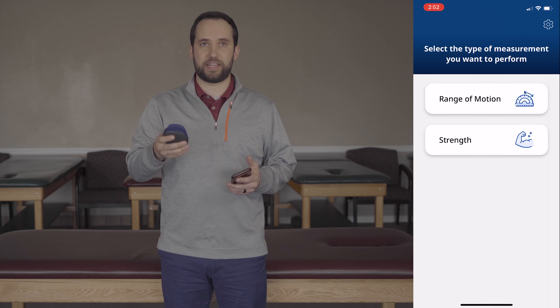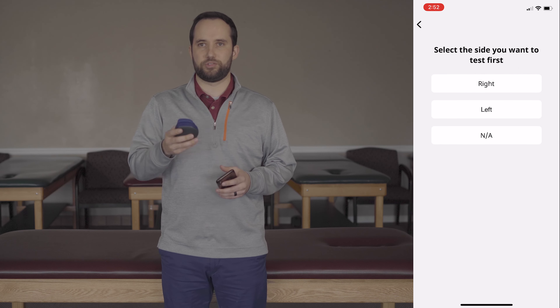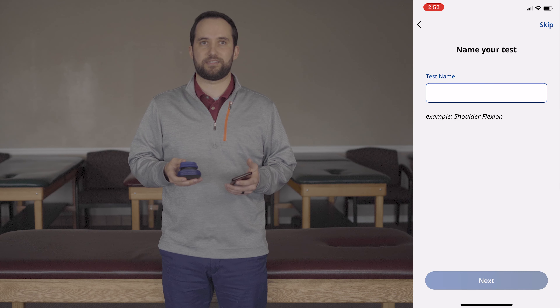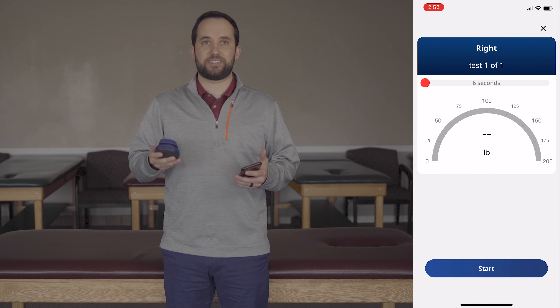To do the strength test, you'll open up the device and hit the strength test button. It will ask you if you want to do the left or right side. You'll choose which side you want to perform first, then you'll have a chance to name the test. If you don't want to name the test, you can just hit skip. That will bring you to the test screen.